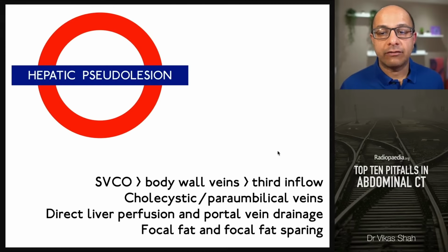And the paraumbilical veins are responsible for that phenomenon in the liver. Now, the paraumbilical veins are part of what's known as the third inflow. So what's the third inflow?